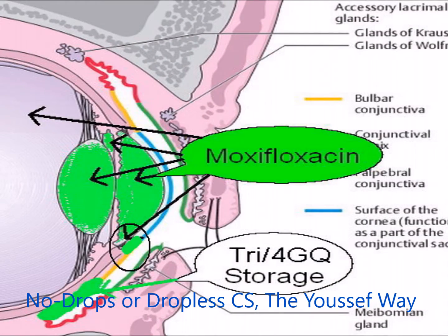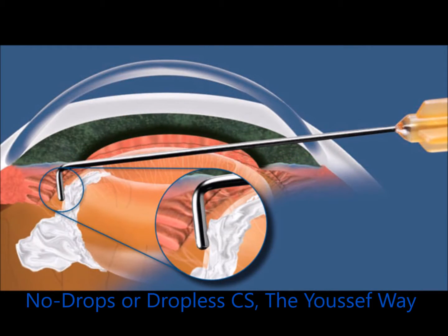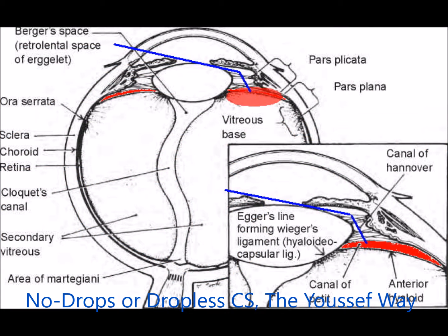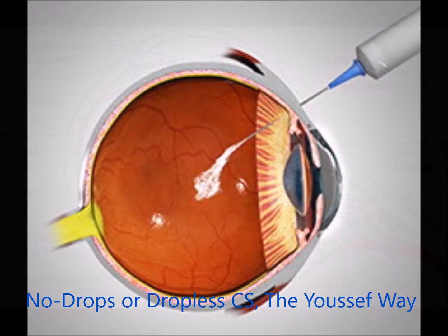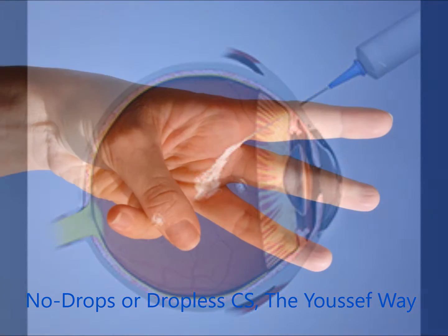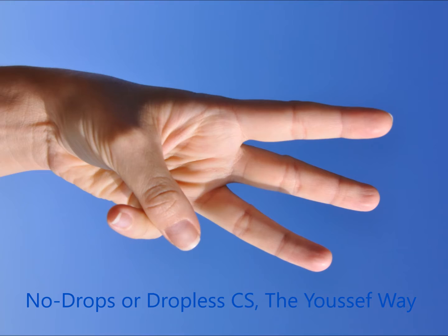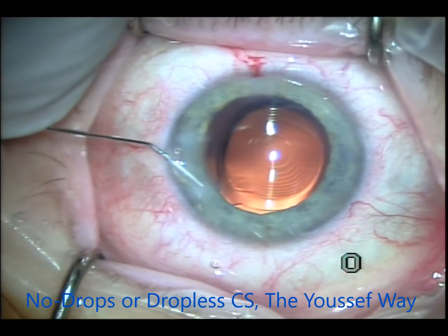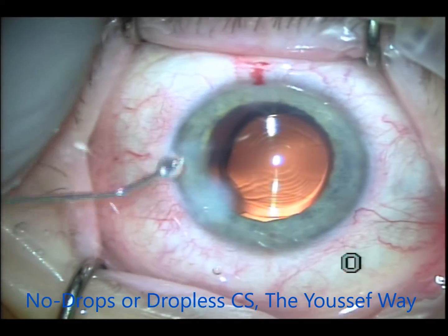This is the Tri-Moxie injected in the subconjunctival space. Again, the moxie goes intraocular and the Tri-Moxie goes in the subconjunctival space. The original description of the Tri-Moxie was to inject it transzonularly into the Berger's space so it stays there, but some of it goes into the vitreous cavity and fogs vision a little. The intravitreal route also fogs vision for a few days.